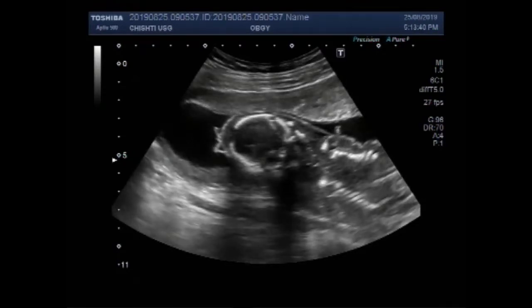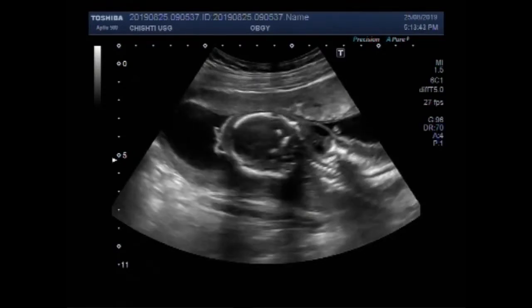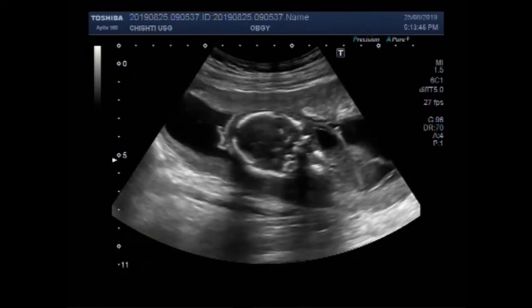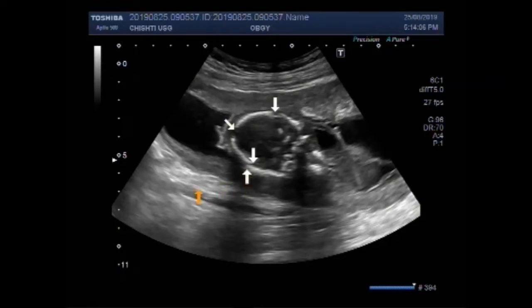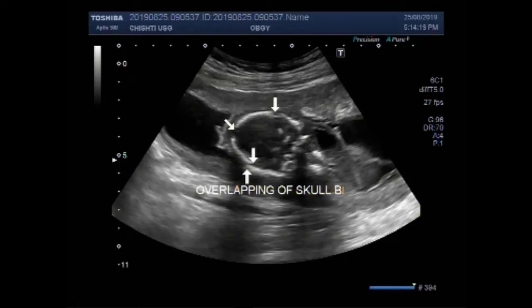You can see the fetal head. These fetal skull bones are overlapping on each other — that is a positive Spalding's sign. You can see the overlapping of fetal skull bones, confirming a positive Spalding's sign.